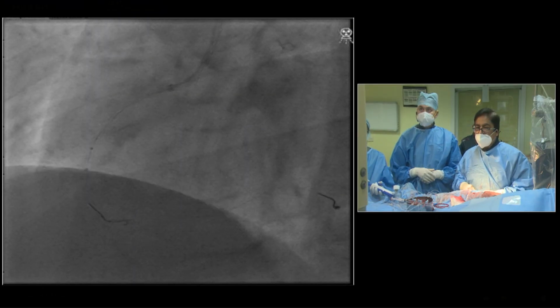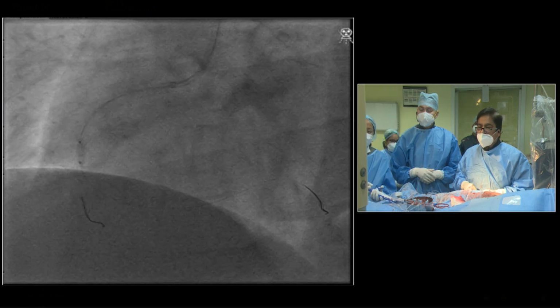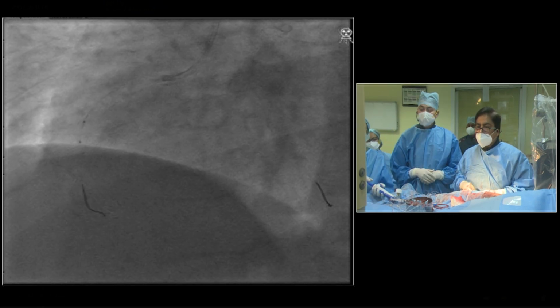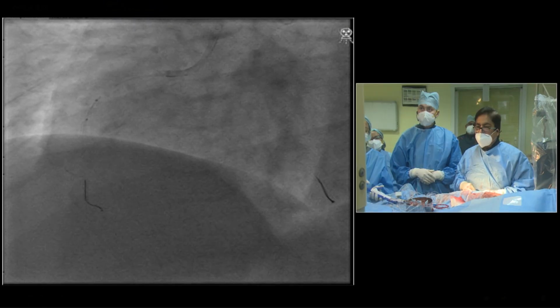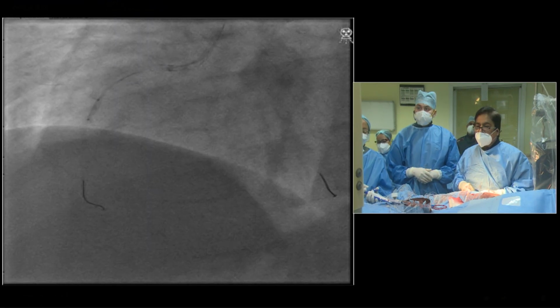Now, actually, it's a very important point. Before putting a stent, he is dilating the other new wire in the distal part, so that he wanted to keep the space perfect. Goel sir, will you put a stent into the PDA or PLV now? I will put it into the PLV.